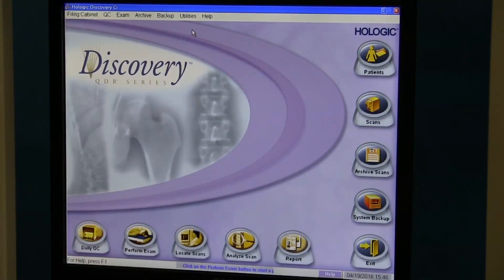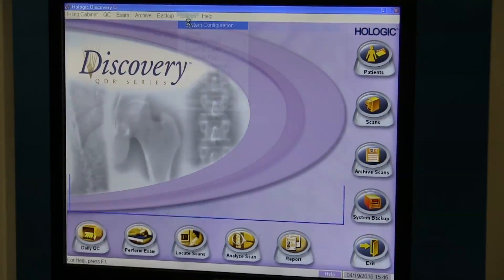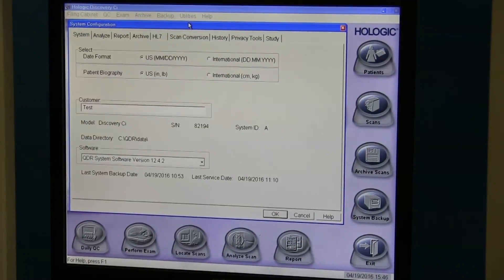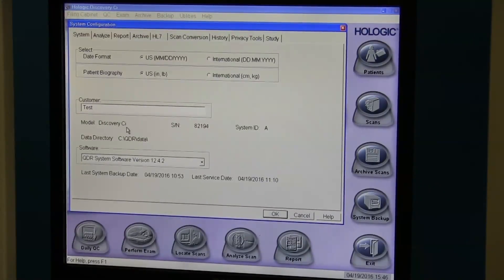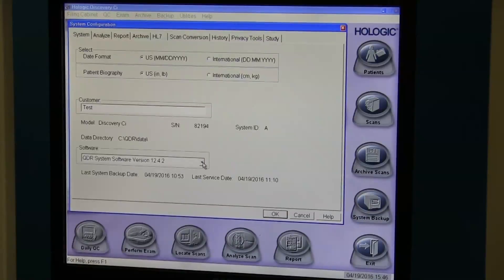Also, by going to Utilities, System Configuration, you can look at the model here — Discovery CI — the serial number for the system, 82194, and then underneath you have software options down here.